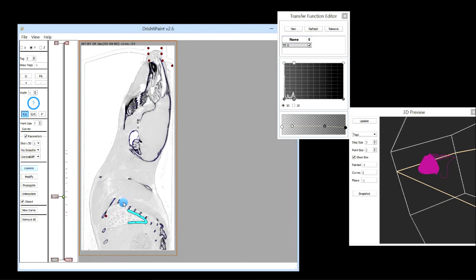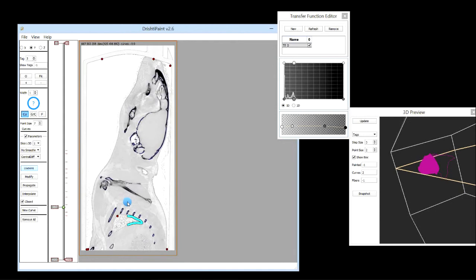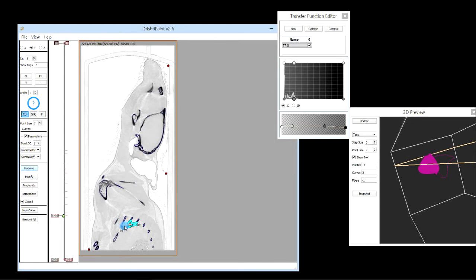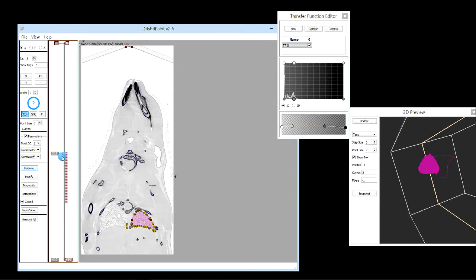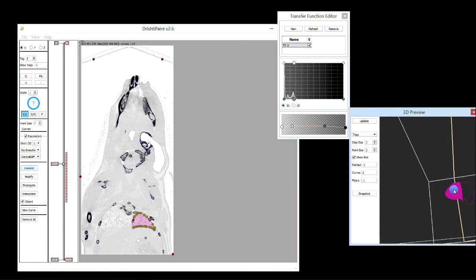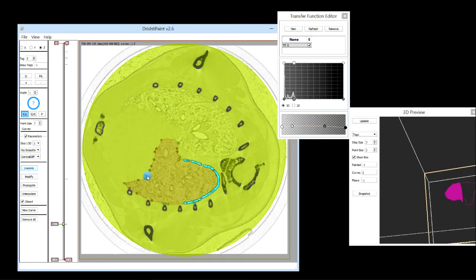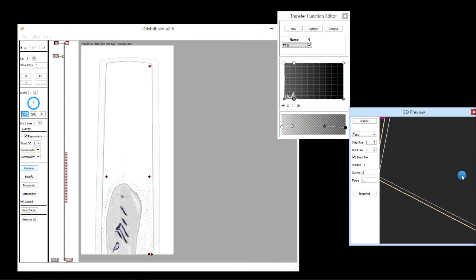I just wanted to show you another way of extracting a region or drawing curves. Interpolation is one method, and propagation is another method. There is one more curve here in the Z-axis. I can just remove it so it doesn't interfere with our data extraction.